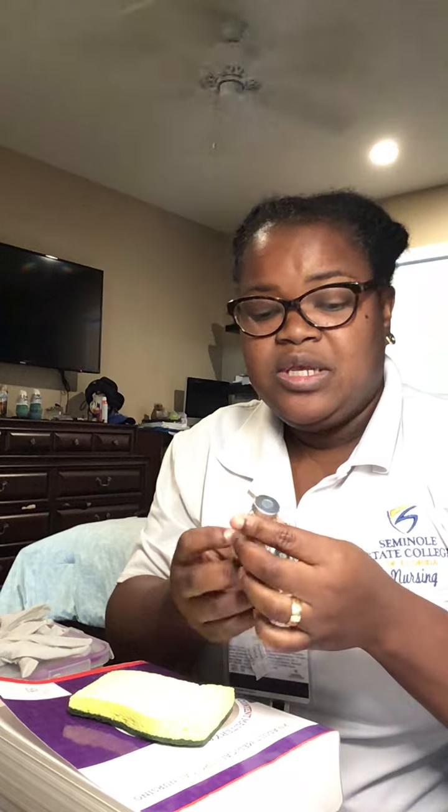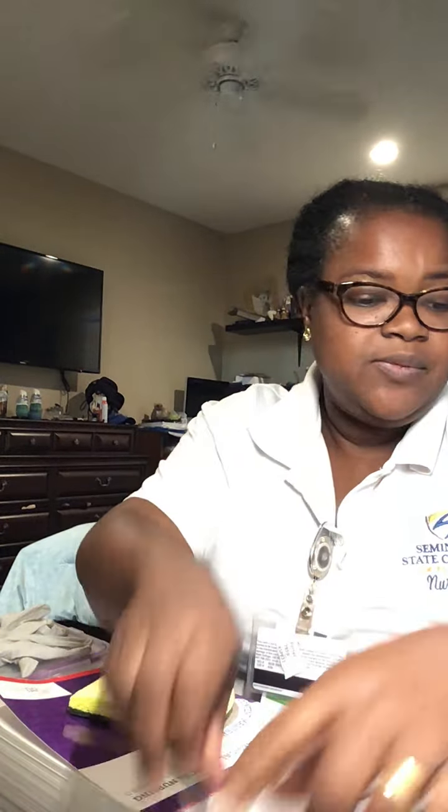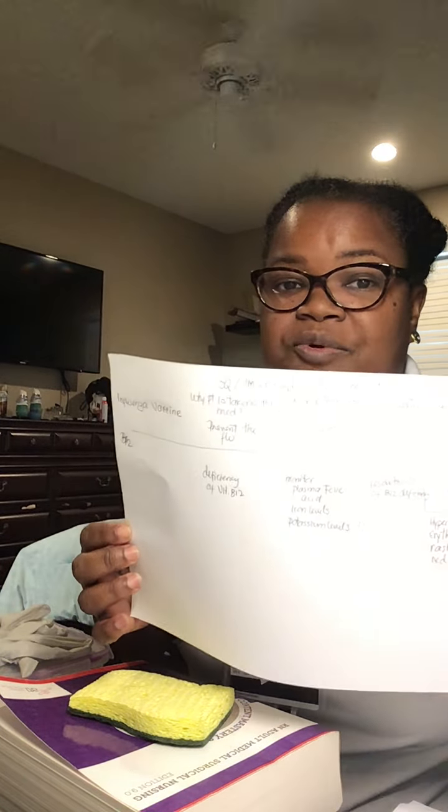Okay, I have to check for any expiration. Neither is expired, the vitamin B12 or the influenza vaccine. I have to write down the information because my printer wasn't working. I wrote down my med card to be aware of the side effects for each one.